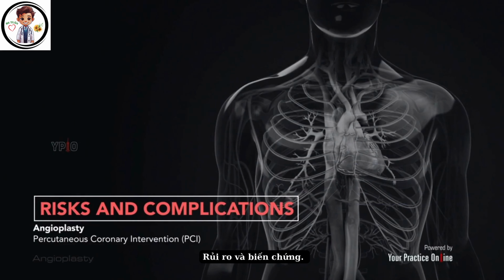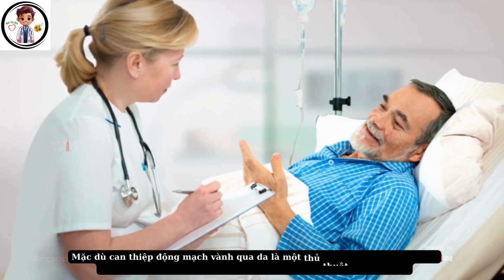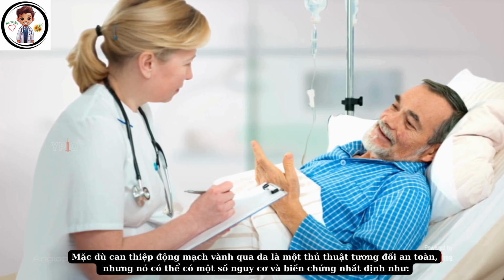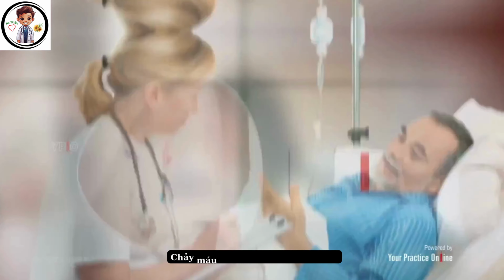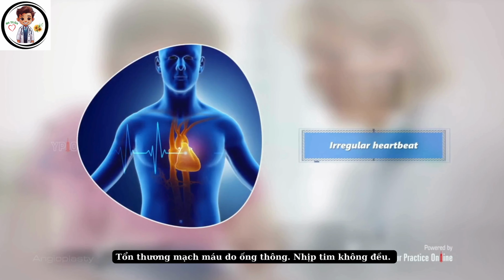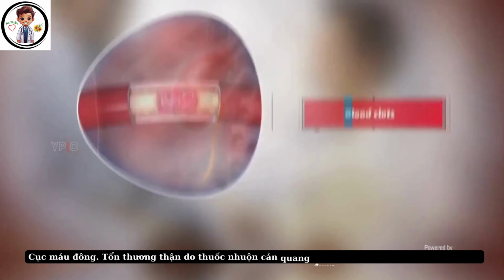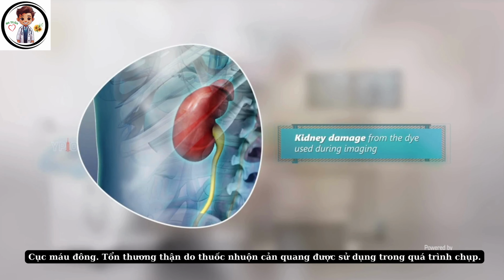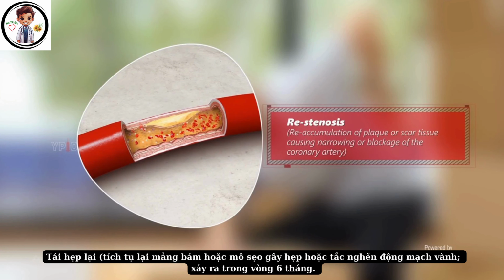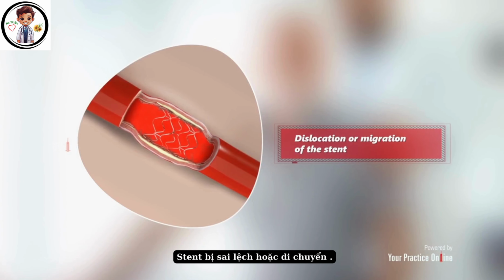Risks and complications. Although percutaneous coronary intervention is a relatively safe procedure, it may have certain risks and complications, such as bleeding from the catheter insertion site, blood vessel damage from the catheter, irregular heartbeat, blood clots, kidney damage from the dye used during imaging, restenosis, reaccumulation of plaque or scar tissue causing narrowing or blockage of the coronary artery, occurs within 6 months, dislocation or migration of the stent.